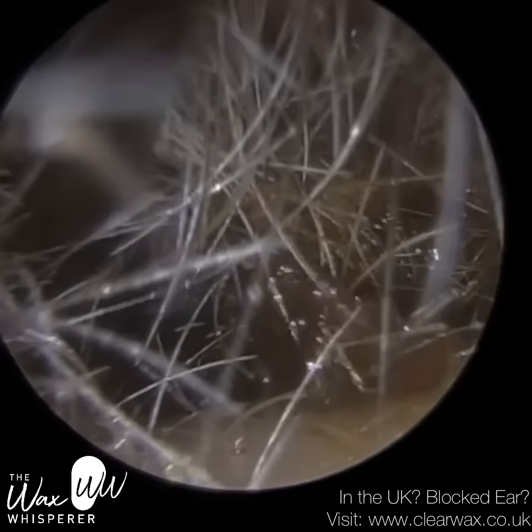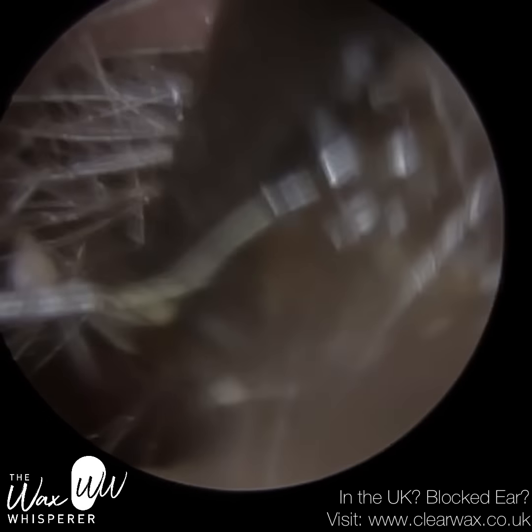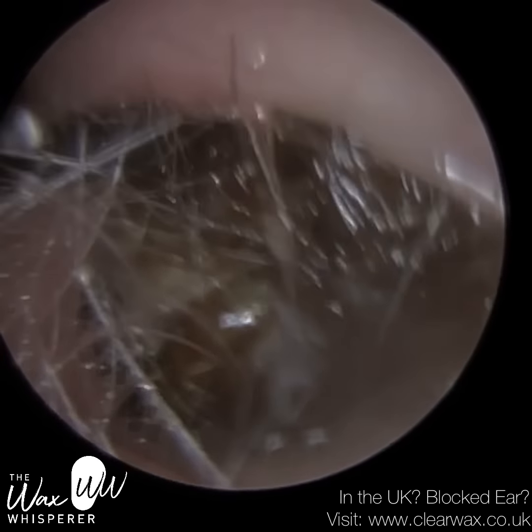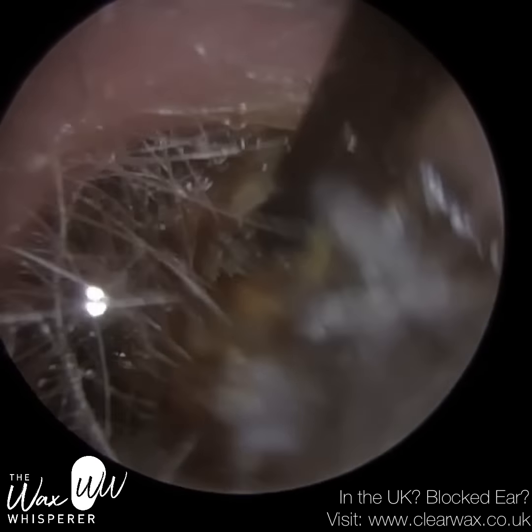We've managed to loosen the wax plug, bring it forward, and take it away from the eardrum. So I'm just using the earhook, trying to get in and behind. And I'm re-entering the hook at the roof of the ear canal.